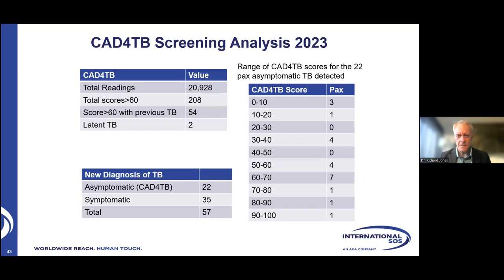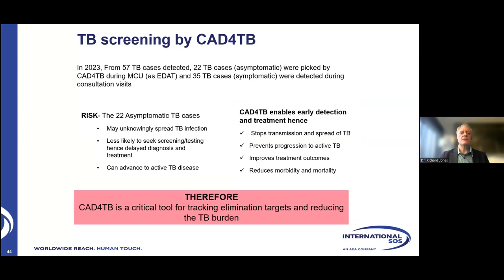Next slide, please. So we've recently added the CAD for silicosis, and we're working closely with Delft to now help us interpret where to set our threshold in terms of our index of suspicion, because escalating these cases, especially in a mining environment, has a certain occupational impact and potential consequence. So I apologize, it's a lot of information. I wanted to share just this really quick journey with you.